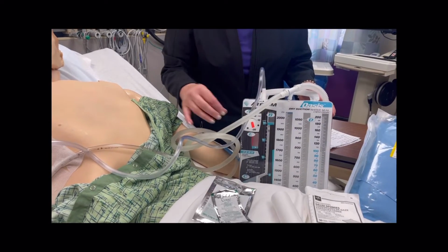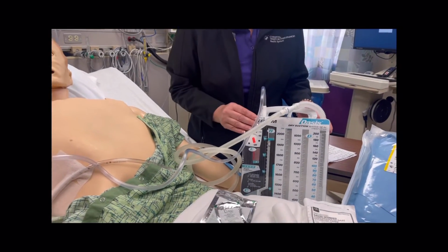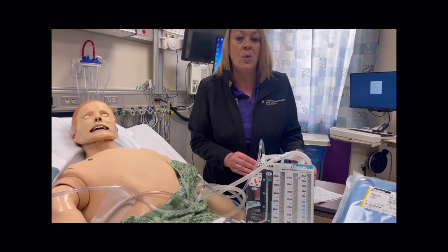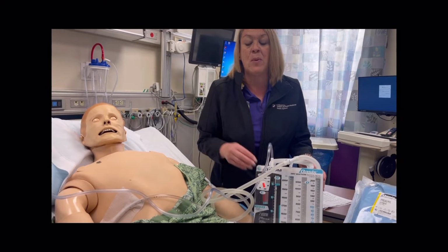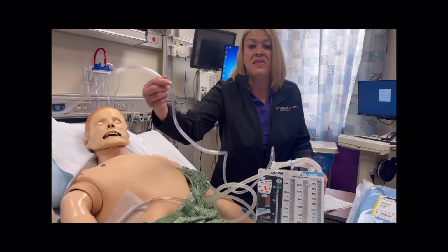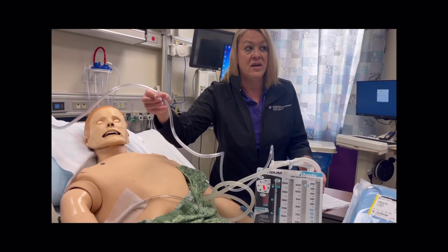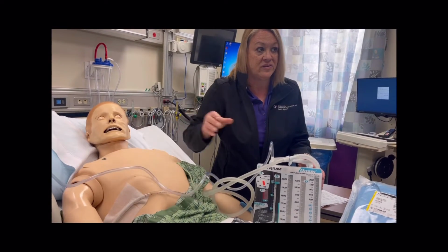If the patient tubing doesn't allow it to reach to the bathroom, you need to use a bedpan or a bedside commode, urinal, whatever you need to do at the bedside, but we don't ever extend this tubing because it will interfere with the level of suction that's provided to the patient.